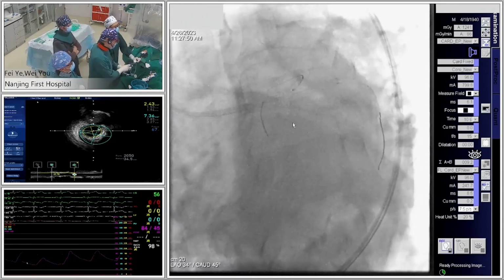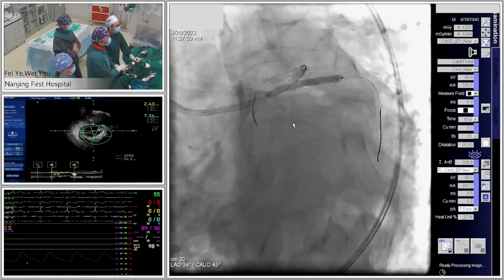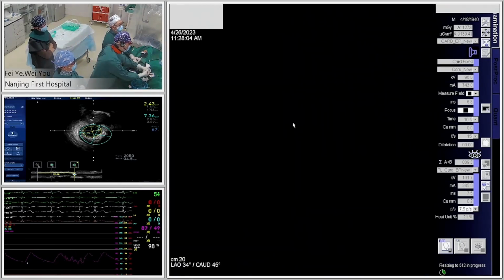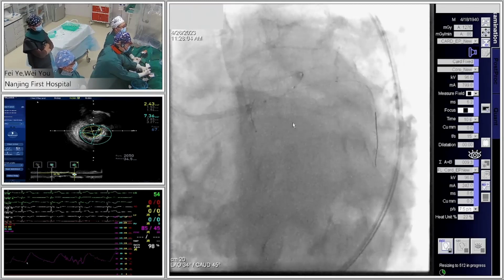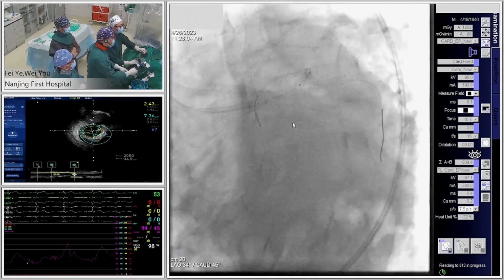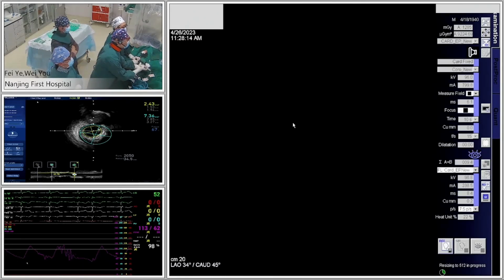That's very important before first crushing. Here. 12, 14. Okay. Yes. Good. We can see the stent full expansion, especially at the ostium of the side branch. So it's very important; we call it the side branch ostium optimization technique.